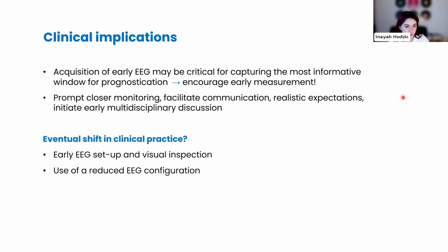So we hope that maybe this could contribute to an eventual shift in clinical practice. So having early EEG setup, early visual inspection, and also the use of a reduced EEG configuration to aid more accurate and more timely EEG initiation and recording.